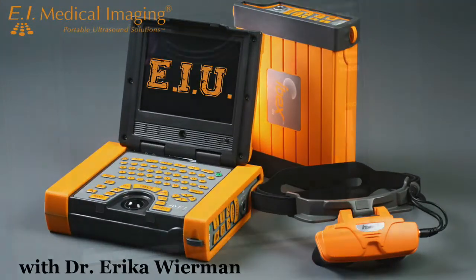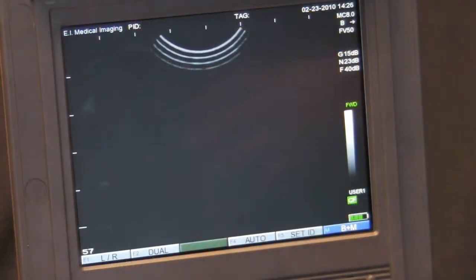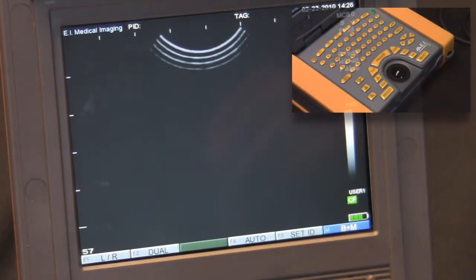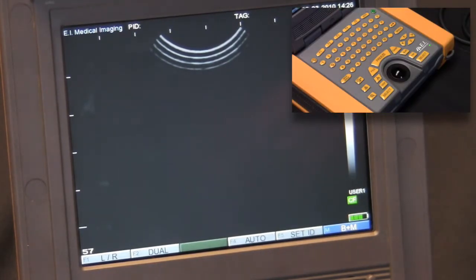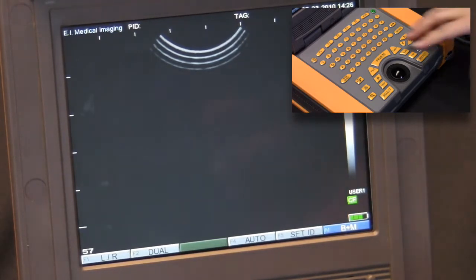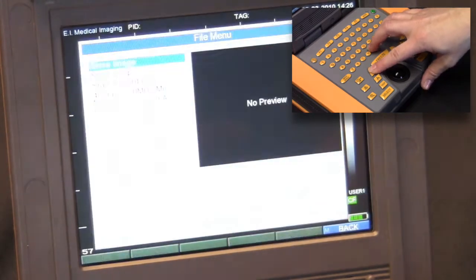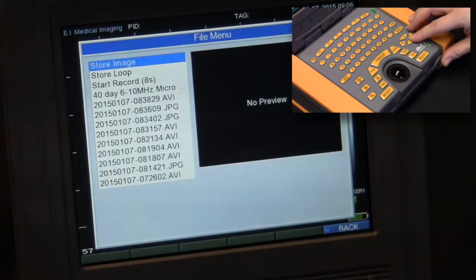Hi, I'm Dr. Erica Weirman. Today on EIU we'll discuss how to take a linear measurement on your IBEX ultrasound. Measurements and annotations can be added to images obtained on the IBEX ultrasound. This can be done at the time the study is performed or at a later time on the IBEX Pro. In this example, I'll pull up a stored image that I've previously saved.